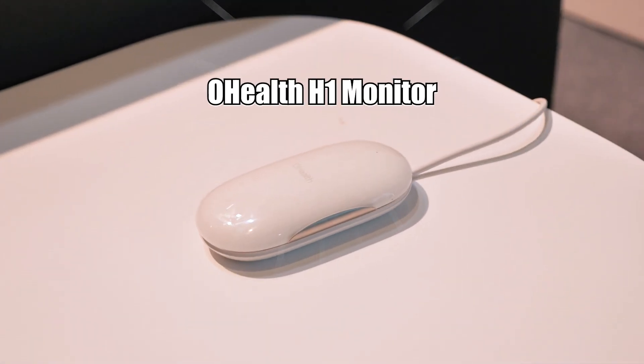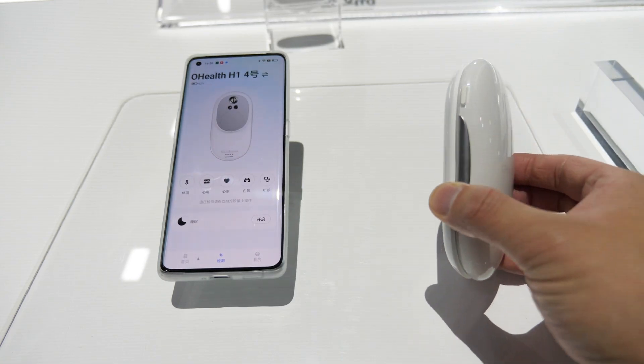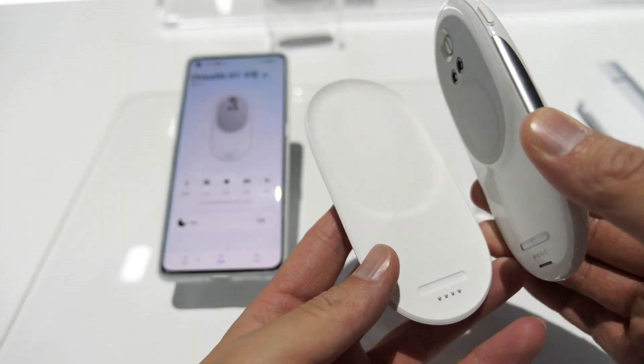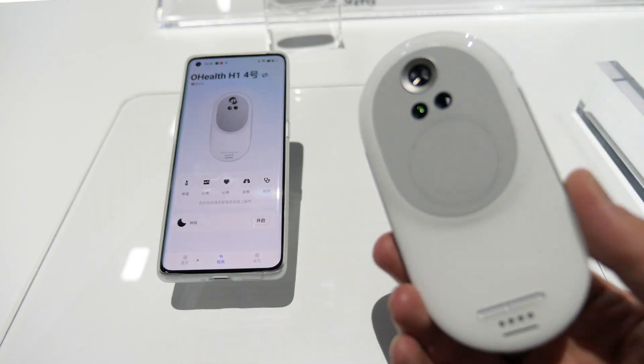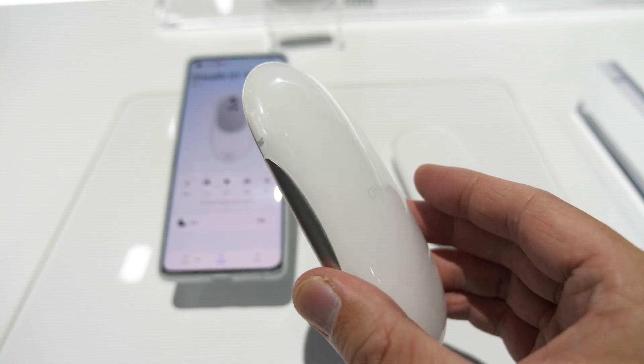They have this OHealth H1 concept device — this is their product. The base has some sensors at the bottom and also one button here.